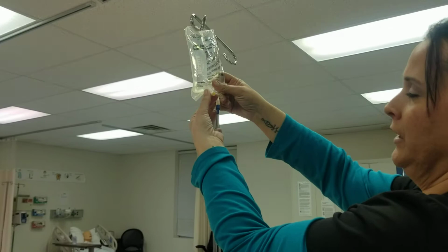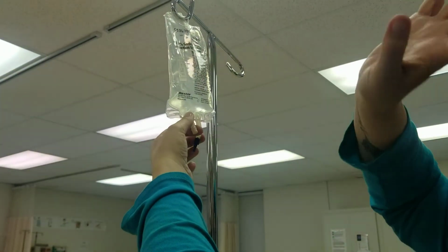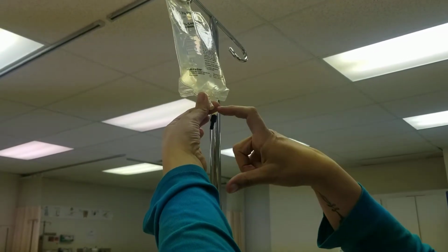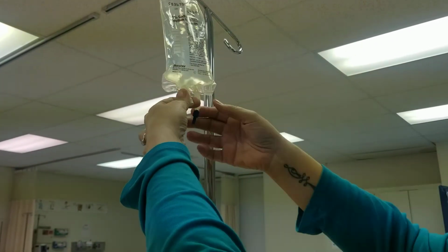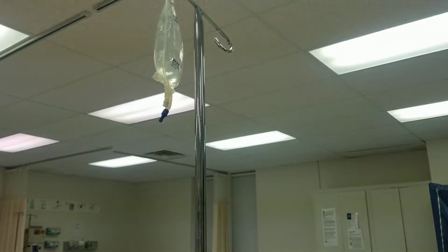This port right here, whenever, like in pharmacy, if they're making your medication bags, they'll take a needle with the medication in there, and they'll access this, and the medication will go in here and create that. This one right here, you'll pop that off. I'll show you right now.